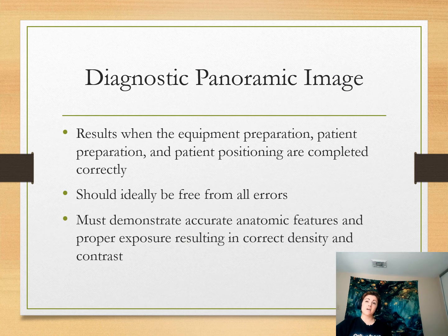All right, so now we're going to talk about what makes up our diagnostic panoramic image.